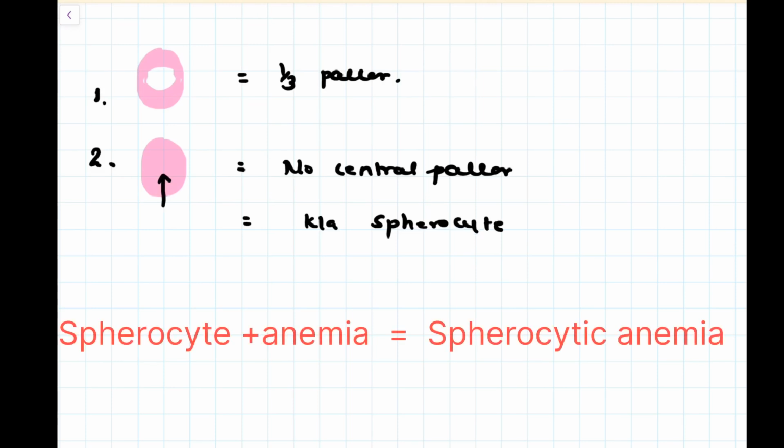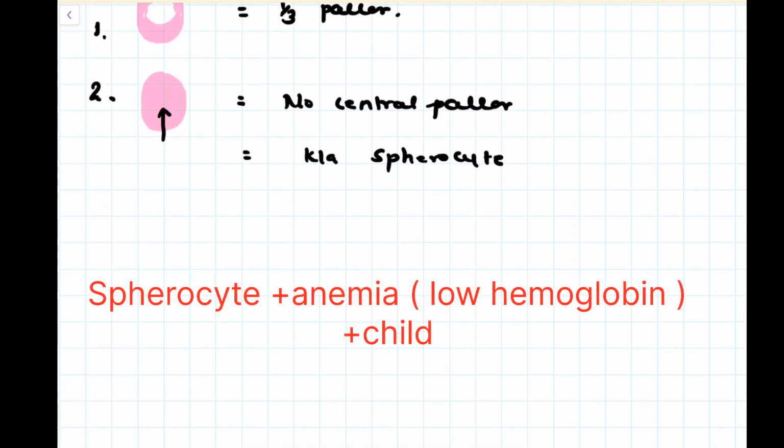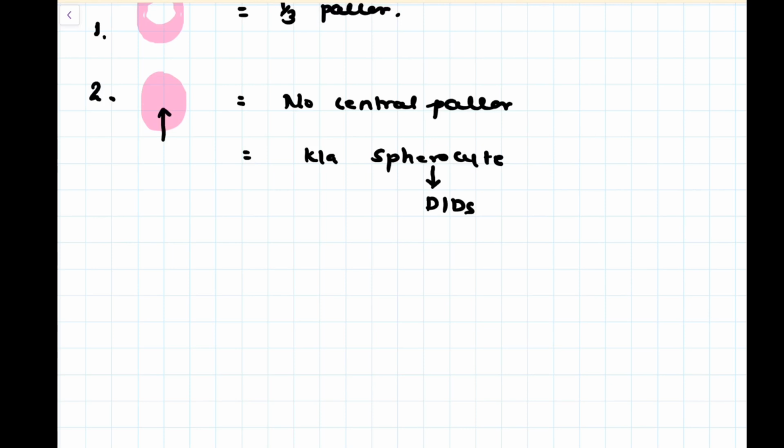spherocyte. So we are dealing with spherocytic anemia here. Spherocytic anemia in a child. What is our diagnosis? Remember, spherocyte have many differentials.